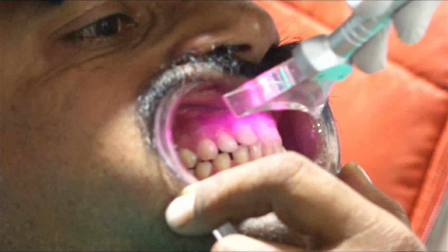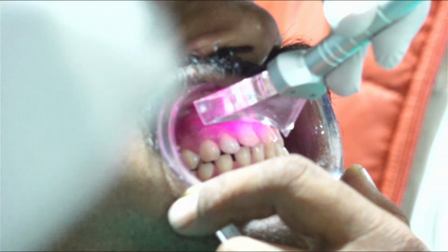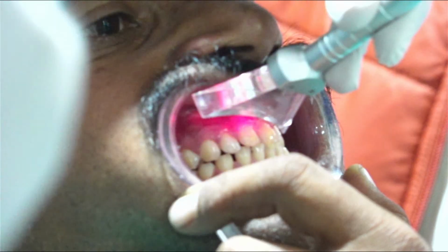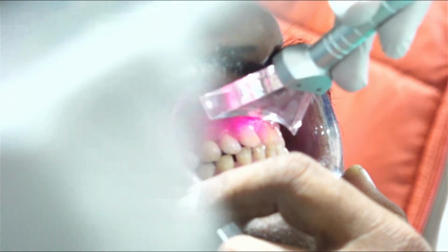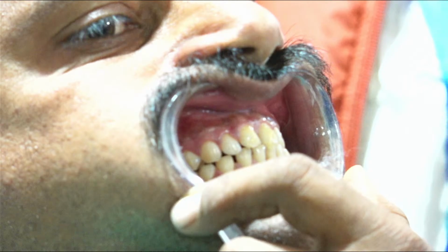Anybody is calculating the time? Machine, what happens? No, I will tell you. In PBM, you always have the privilege of having time at your side that will display because it is calculated. How can you decide on his frenectomy excision how much time you want? It depends on the fiber thickness, fiber length. So whenever you are in thermal zone, it will not display time. You have to decide or you have to time it. In PBM and PDT, you have that. So wait, just give me this tip.